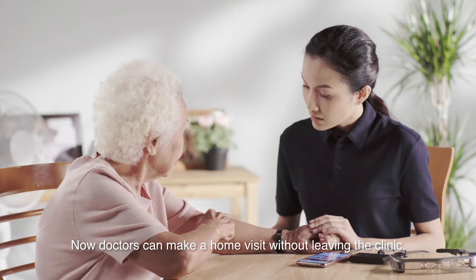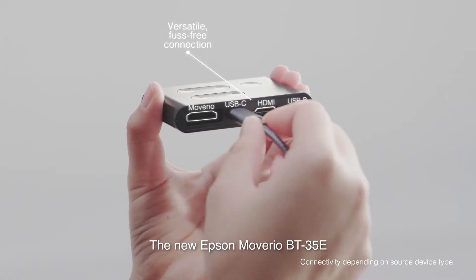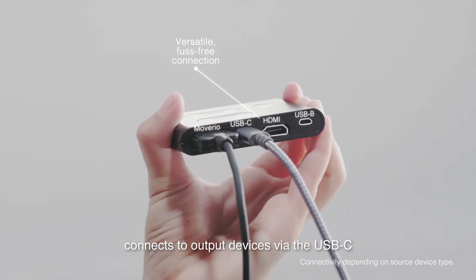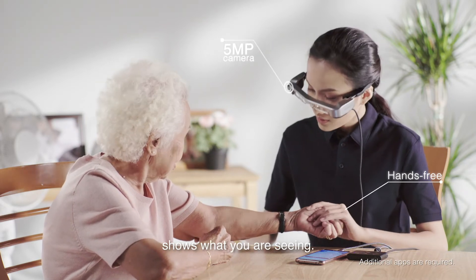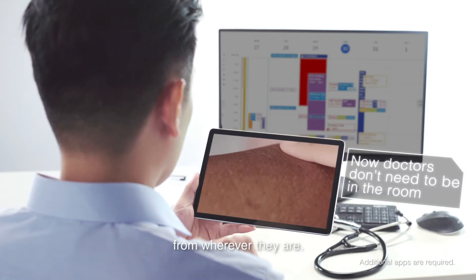Now doctors can make a home visit without leaving the clinic. The new Epson Moverio BT-35E connects to output devices via the USB-C and HDMI ports on its interface, while its built-in 5 megapixel camera shows what you're seeing. So doctors can perform a simple check-up from wherever they are.